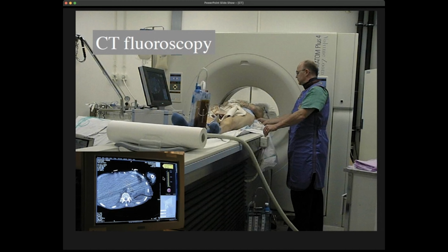Now, we can also use CT, especially when we use filtered back projection, for quasi-real-time imaging. So we can also do interventions under a CT. Typical is doing biopsies, for example, or draining of some kind of fluid cysts.